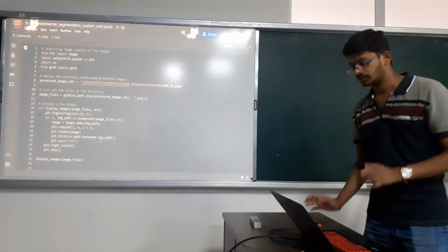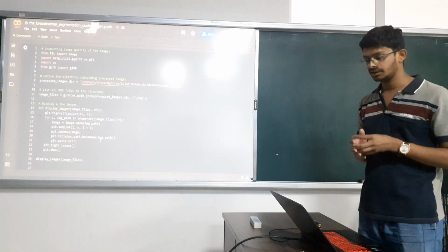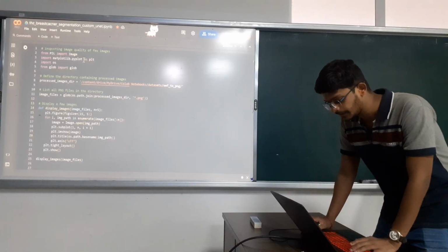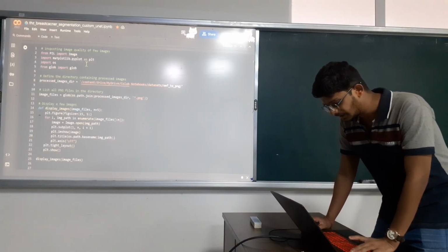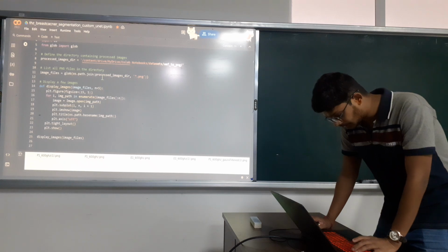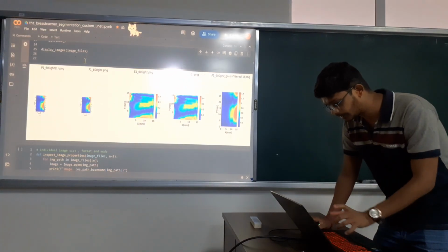So once I have converted all the image files to PNG, now I want to inspect the image quality from the Google Drive and extract here. Let us see how this is done. I've imported PIL here. PIL is used for traversing the image files, and the directory I've used here is content with EMF to PNG at the end. Then, using PIL and the glob function, I have displayed all the images that I have converted to PNG format.